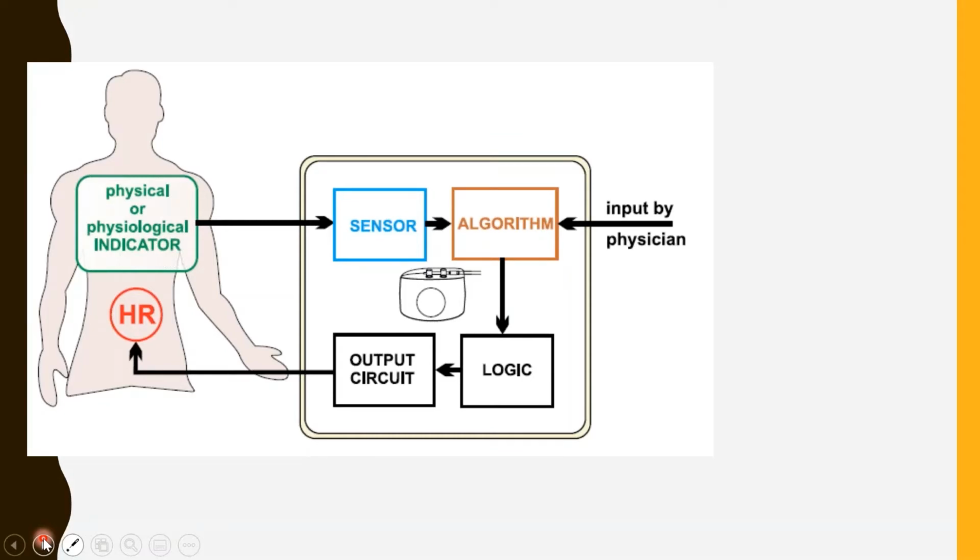I've always known the pacemaker to be a device that allows us to pace the patient whenever they suffer from any bradyarrhythmia. But what is very important for a pacemaker is the rate responsive aspect of it. Meaning to say that if the patient requires any increment in pacing rate, this intelligent device should be able to adapt to it.